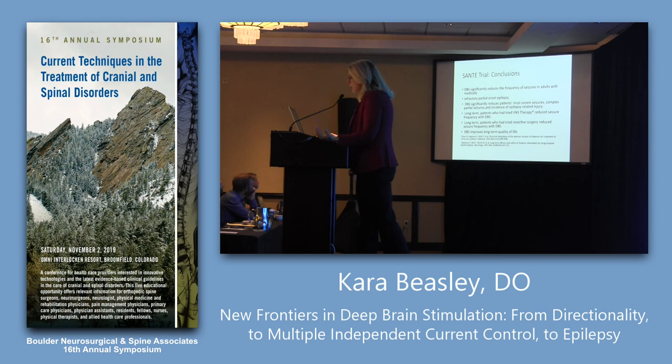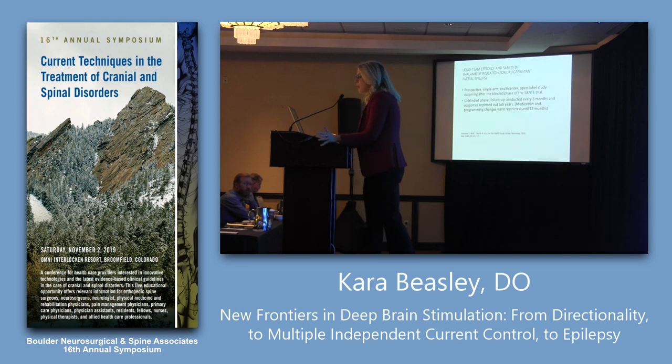So the results of the Sante trial were that DBS significantly reduces frequency of seizures in adults. They must have medically refractory partial onset epilepsy. It reduces the most severe seizures, and I'm going to show you the seizure severity score in a minute, of their complex partial, and it also reduces, because they're not having as many seizures, injury related to their epilepsy. And then long-term, it also works in patients who have had VNS, and guess what, it also works in patients who've been resected and who are seizing through their resection or their VNS, and ultimately improves their quality of life.